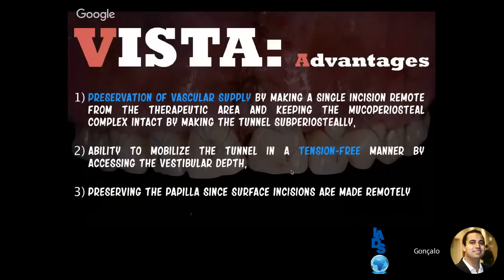So the advantages of VISTA. As I was saying, I think it's one of the greatest advantages of this technique, is that it allows us to do in 1 single procedure the treatment of multiple gingival recessions, and you can do the whole procedure just with one incision. So we do that vestibular incision right at the midline, and with that small incision, we can cover a whole maxilla or mandible just with one incision.